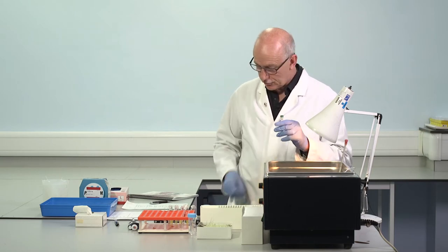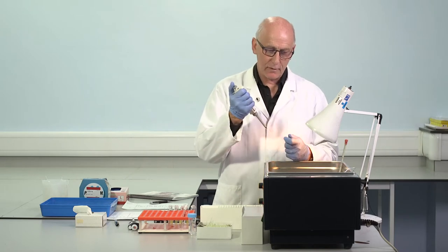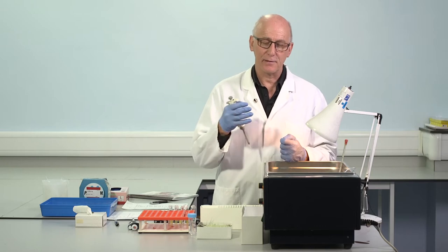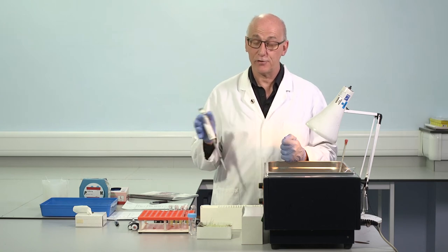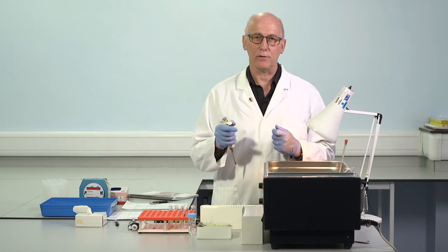Okay, so we're going to test the control. The volumes of testing for manual should be the same for automated systems: equal volume of plasma, same volume of APTT reagent, then we have an incubation that we'll talk about, and then recalcification, again an equal volume.